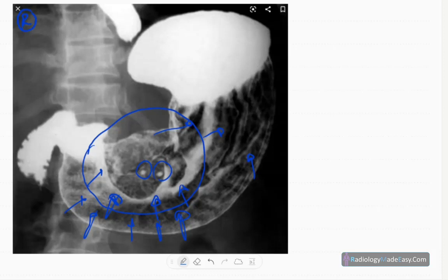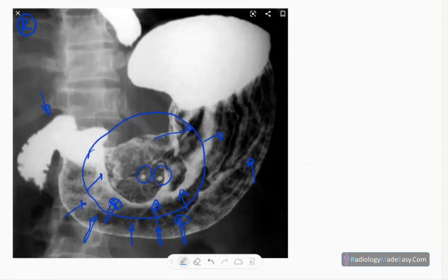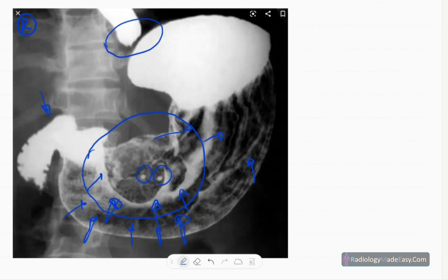However, there is passage of contrast to the first part of the duodenum, so there's no complete obstruction, some kind of partial obstruction is there. The gastroesophageal junction is at the normal position, no lesions in the lower esophagus or the fundus.